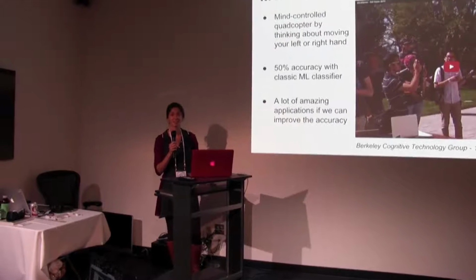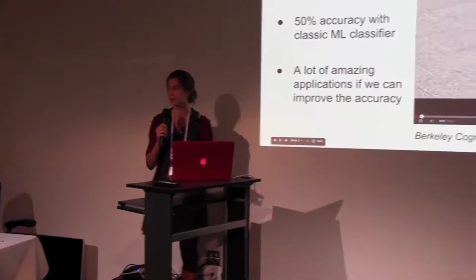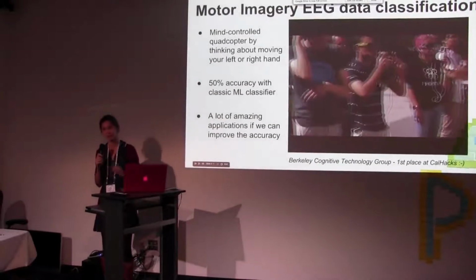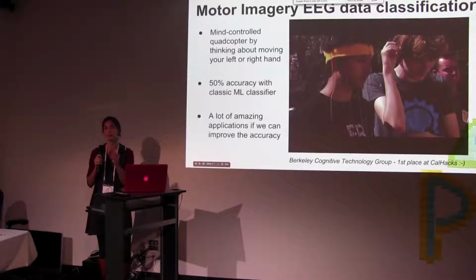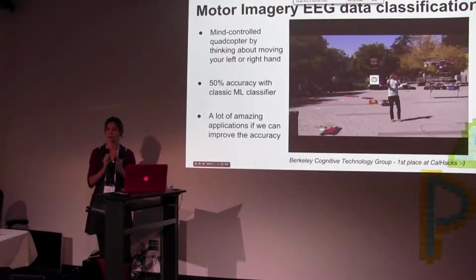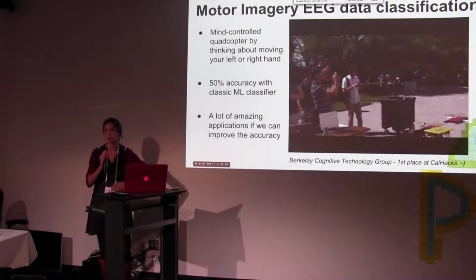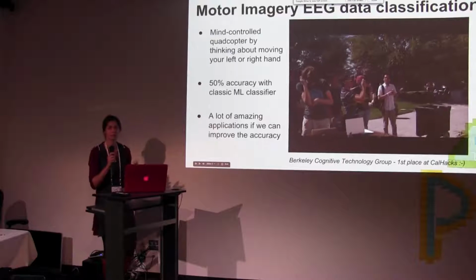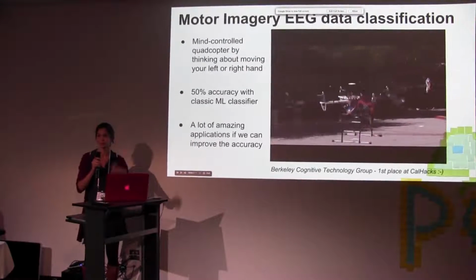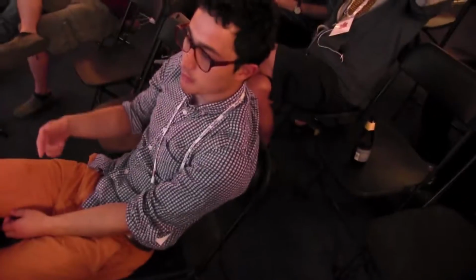Yeah, so when it worked, I was like, yes, this is going to be so great, because this is a game, right? But for actual application this is going to be amazing. And you think one channel is actually enough? No, I think if we combine all of them, I can reduce the 400 milliseconds and potentially, I hope, again, I need to investigate that, take a smaller amount of data and combine all of my anomaly scores. Channel 0 is a useful one, but my assumption is that if I combine all of them, it's going to be really good. You can probably process all of this data streaming and classify in real time.